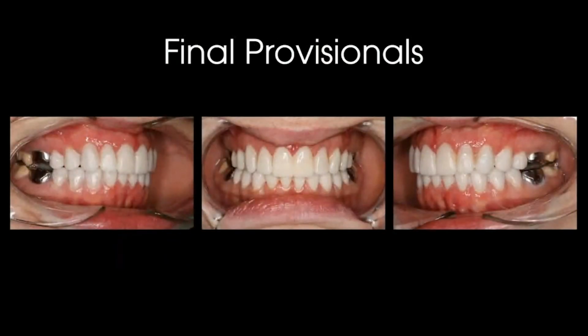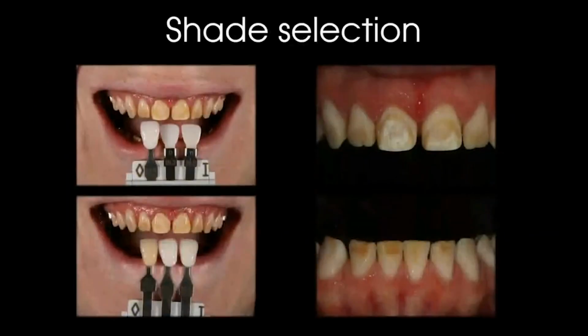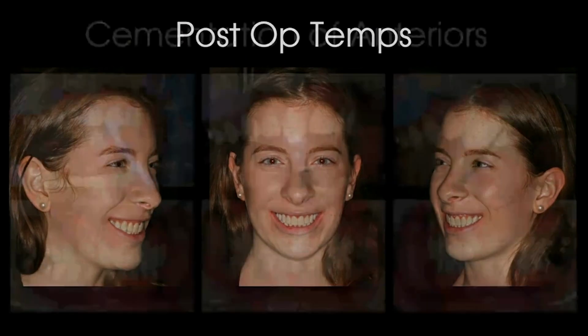And the final provisionals look like this. All right. So now you notice the molars aren't touching because we're going to work with those later. I think it's much easier for me to control the case this way. So we went from 11.5 millimeter central and also the CEJ to CEJ is now 17.5, close to the 18 that I wanted. Here we're picking the shade for Katrina and using the Polar Eye as well. Here's her post-op temps, and you can see she looks pretty much like a different person already.